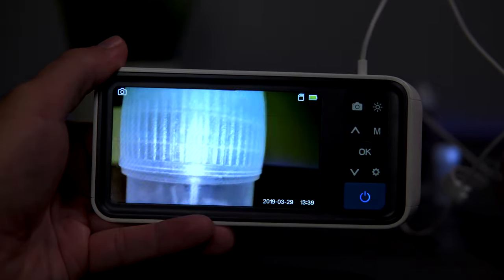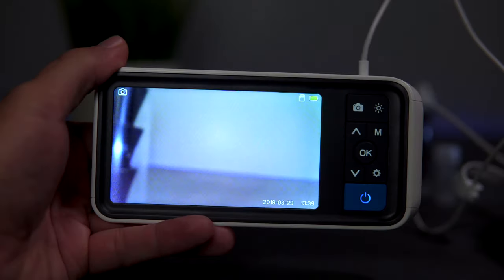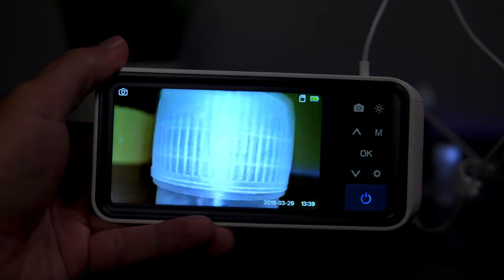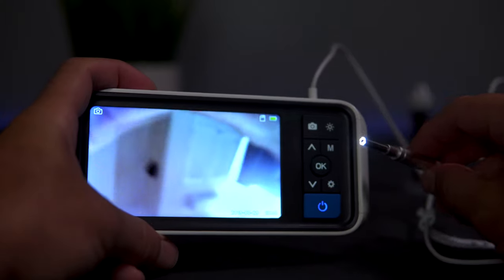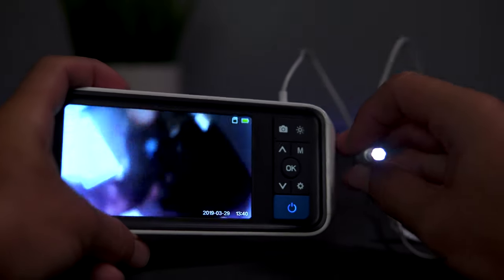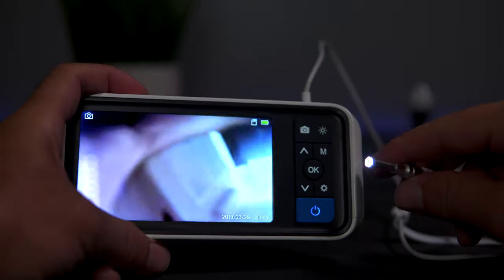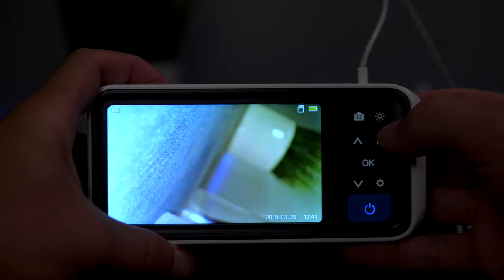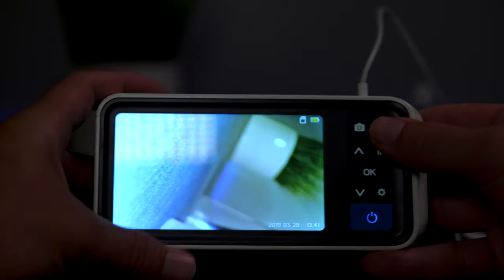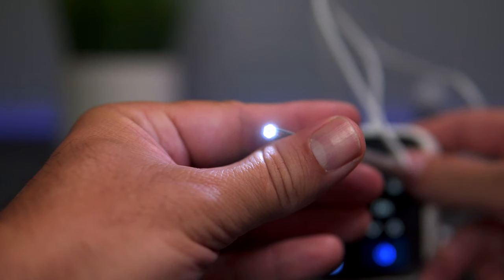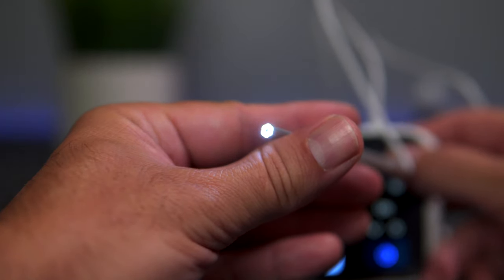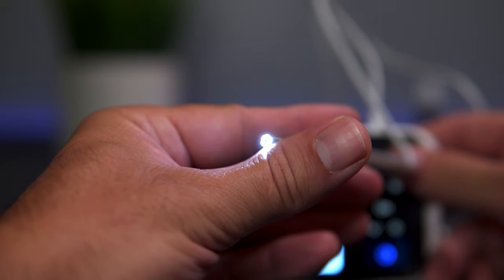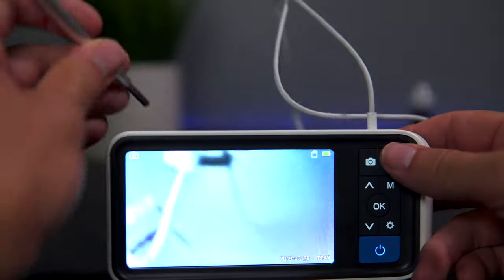The exposure is automatic. You can see how it brightens up or darkens. There's a little light that glows out of the probe here that is actually adjustable by clicking this light button. As you click it, it changes the brightness. So it's off right now, and if I click it again that's full brightness. We've got three dimming modes and off. I'd say the mid one should be a good balance.